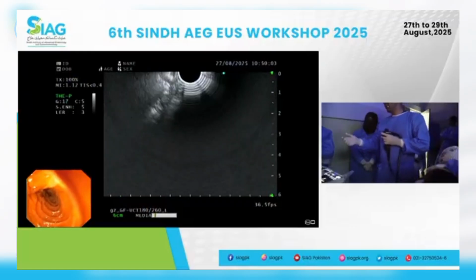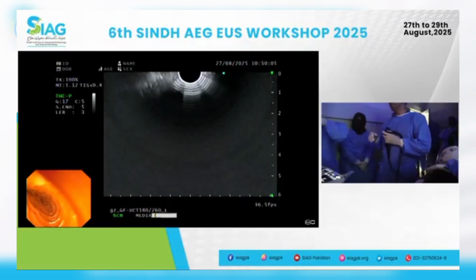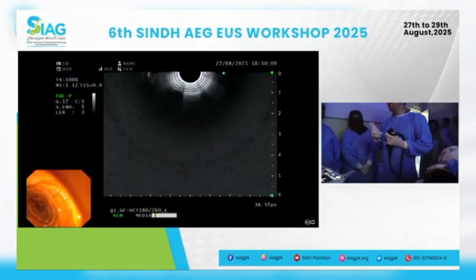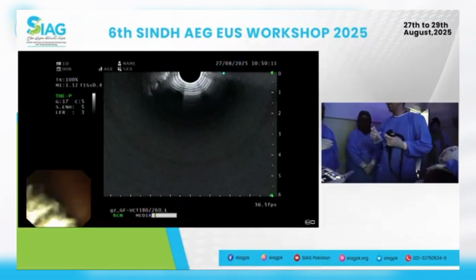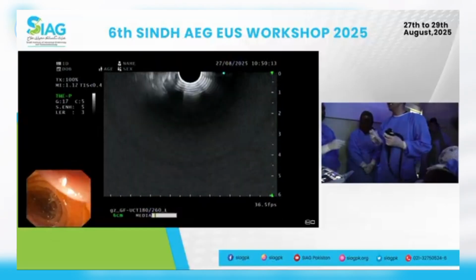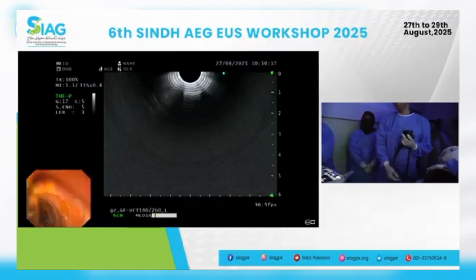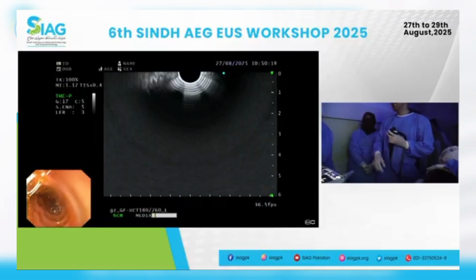What's the pani dijega, water dijega? Just give me a little bit of a... I think it's working, obviously, because you've got too much air in, so that's fine. I think it happens. Every time we're trying to intubate, we end up putting more air in, and that's what can cause problems. But that's fine. Should be okay.